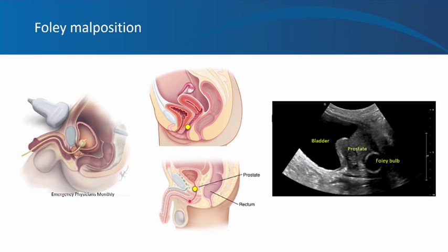In a male patient, you can prematurely inflate the Foley bulb in the prostatic urethra, also causing obstruction. The grayscale ultrasound image shows a full bladder with the Foley bulb in the prostate gland — inflating the bulb there means the bladder is not draining and remains full. Always pay attention to normal anatomy and the location of the Foley bulb.